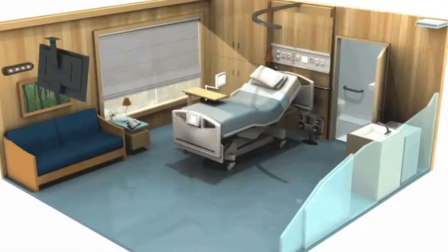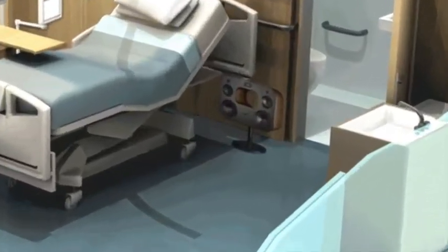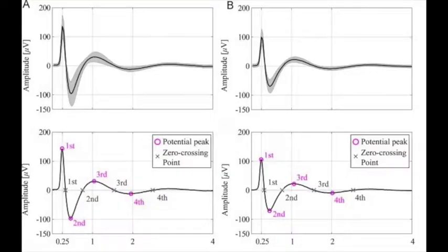The music can be controlled by blinking to cause a large wave in the alpha rhythm output over the frontal lobe. Eye blinks act as dipoles and are very noticeable when they occur. In order to determine a voluntary eye blink, the algorithm will analyze the amplitude and the first zero point of the wave. Image A is the voluntary eye blink, which has a higher amplitude and faster occurring zero point when compared to image B, the involuntary eye blink.